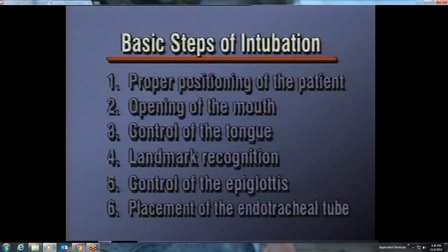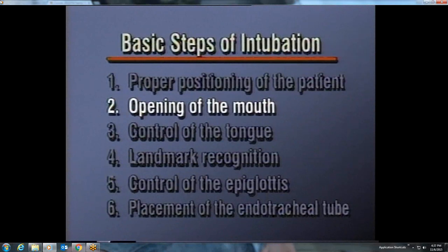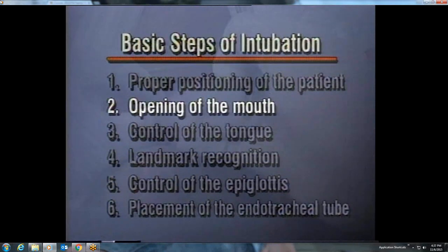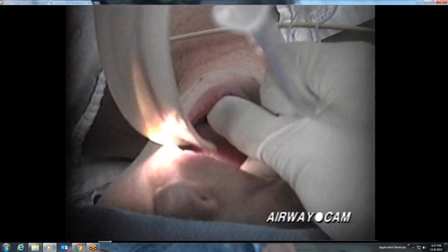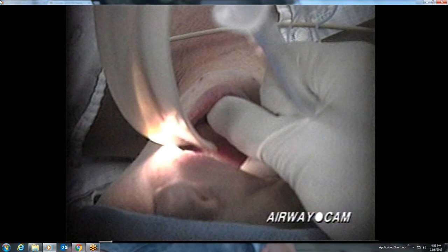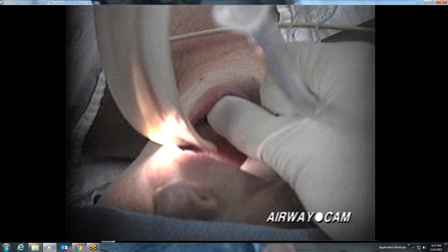The second step in orotracheal intubation is opening of the mouth. This can be done with a scissor technique using the thumb and middle finger of the right hand. The thumb is placed on the lower teeth and the middle finger is then used to push away the upper teeth. Remember, inserting fingers between the teeth of semi-conscious or awake patients can be dangerous.